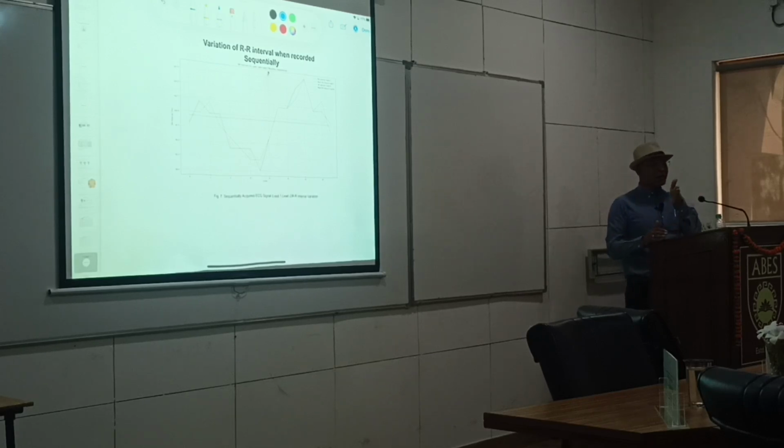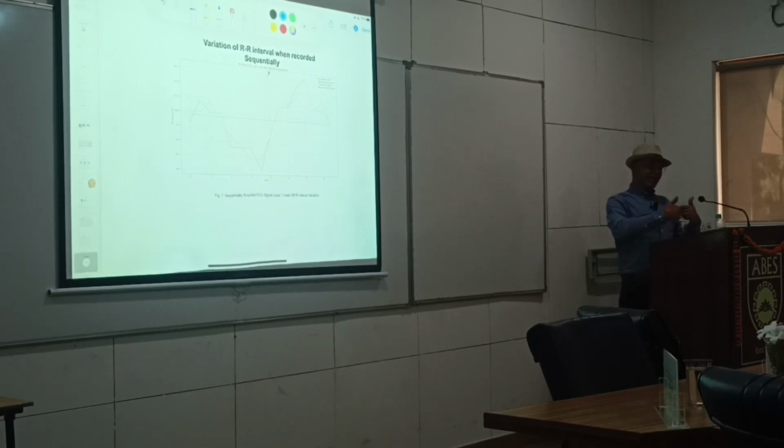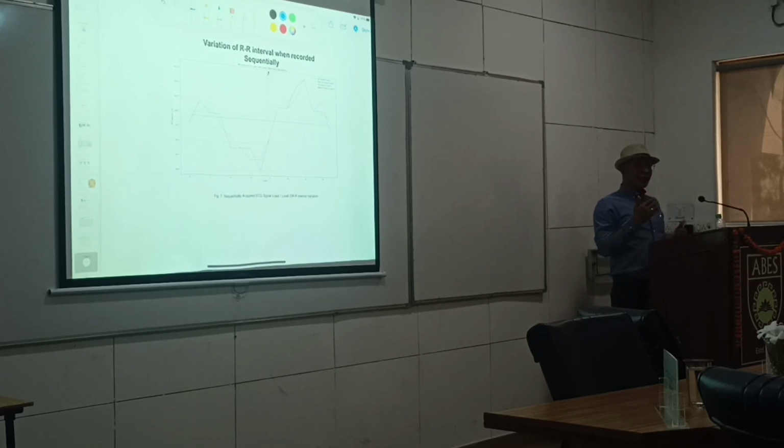60 beats per minute means that in 10 seconds you have 6 cycles. Generally, in ECG, you require 6 or 7 cycles. So that means you have 10 seconds, 10 seconds. But then when you are moving your electrode from here to here, there is a time gap of say 1 or 2 seconds or 3 seconds, let's assume. Then the waveform will not be synchronized with respect to V1 to V6. That is not a matter of serious concern.